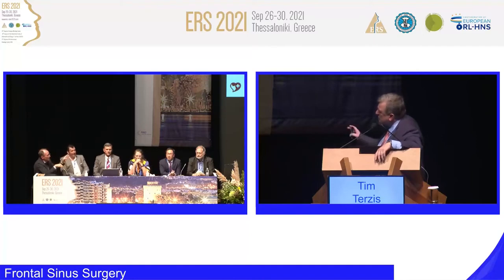Okay, and it's looking always the same. It's looking like this CT scan. There's absolutely no pathology, nothing. And the pain is on the other side. Exactly, and what you see is just a little osteoma, no disease in the nose, nothing. I would be very conservative in this case, so that's Wytske?